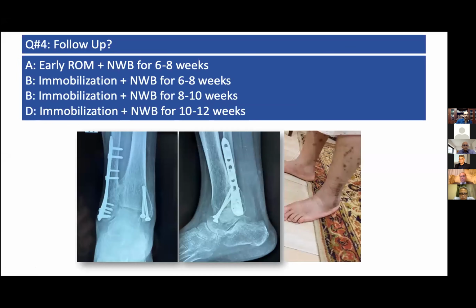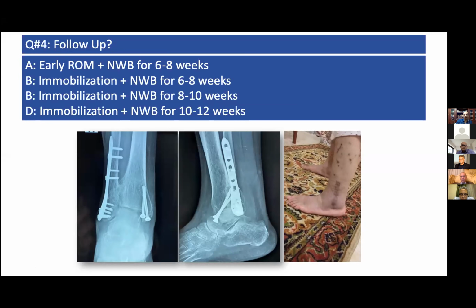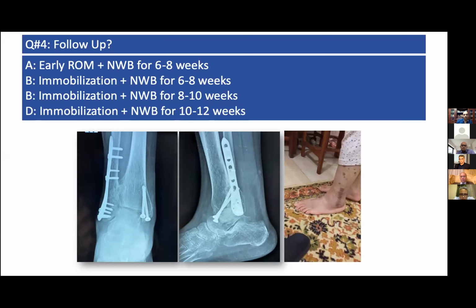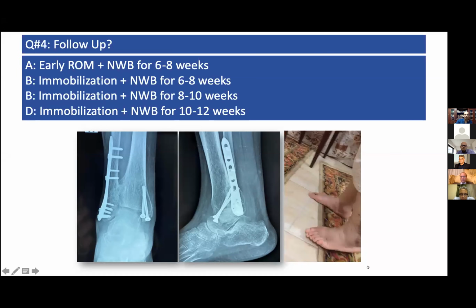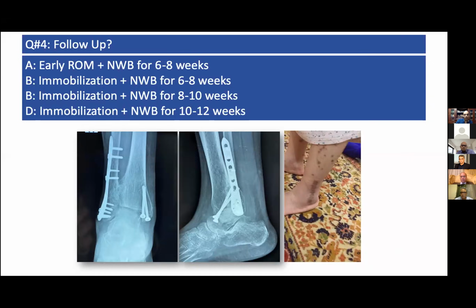And this is the follow-up of the patient after fixation. And here is the walk of the patient after fixation, after removal of the cast at the end. And she went very well with preservation of the ankle without any problem, and she is walking on her feet. So this is one case, the first case I want to show you about fracture in diabetic.